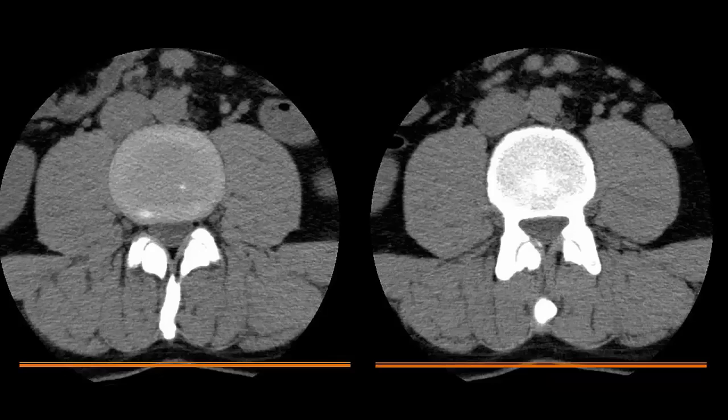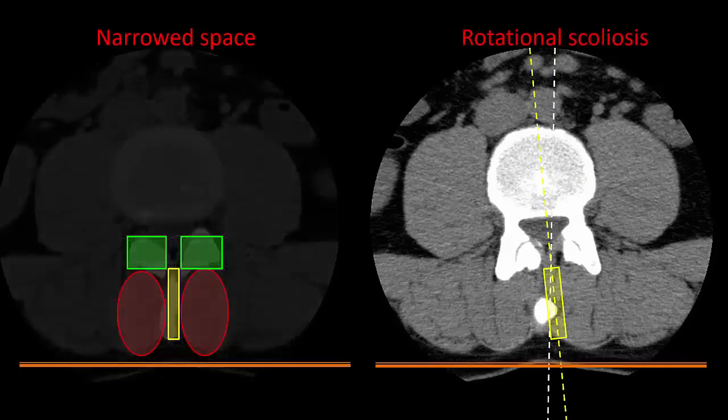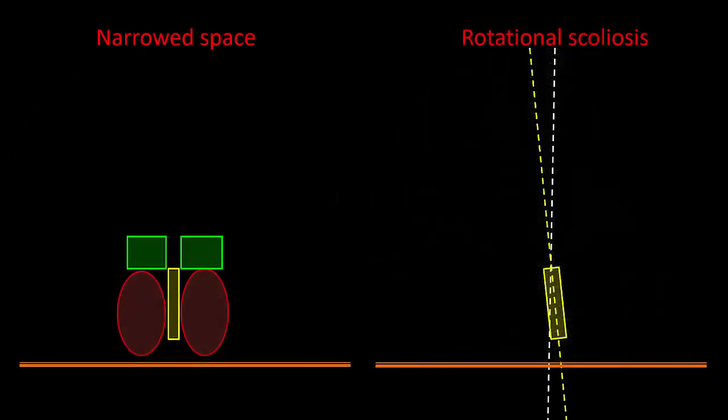More importantly is what happens when we have someone with degenerative changes in their spine. There are narrowed spaces due to more prominent and hypertrophied articular processes. A degree of scoliosis is also not uncommon, making the true neuraxial midline and needle trajectory even harder to discern.